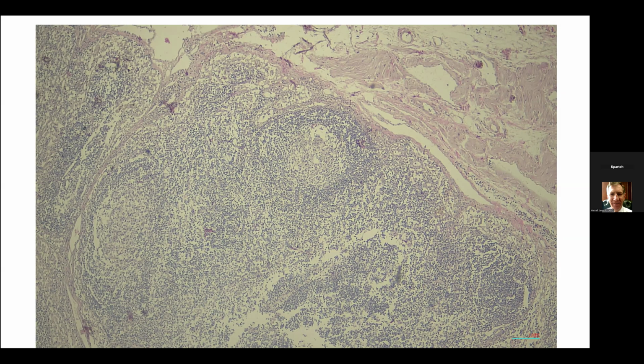So I had a total of 20 slides, even though most of them were repetitive, but I had to find this particular component, which I was concerned about, especially for this particular slide. Even though I didn't see any arrangement of rosettes, I was suspicious for this slide.